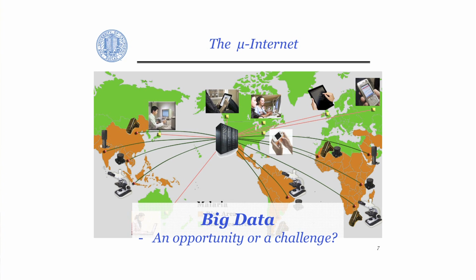So all of these are being enabled by the current status of the cell phone, again, the hardware and the software being together. And we value these components a lot because they're cost-effective, lightweight, and compact. But at the same time, there's something more valuable, which is the data, the data that you can capture with these gadgets from wherever they work. And that I think is extremely important because these smart devices form a network, and the network is very, very valuable.